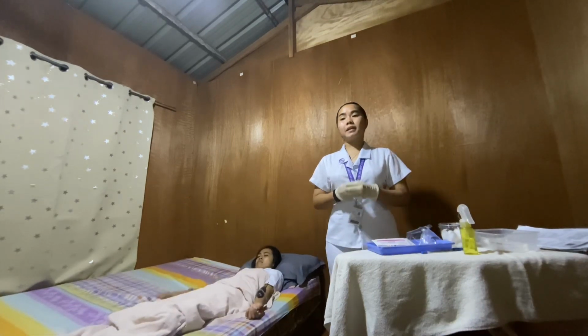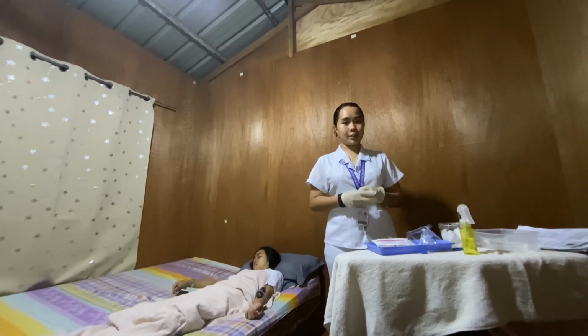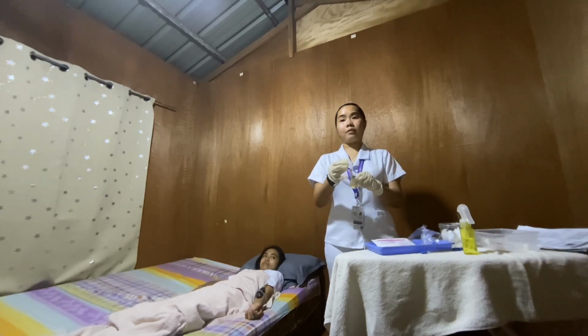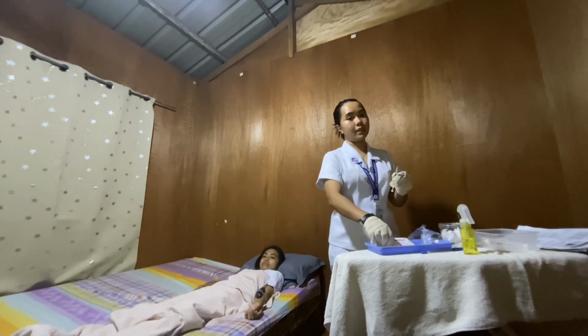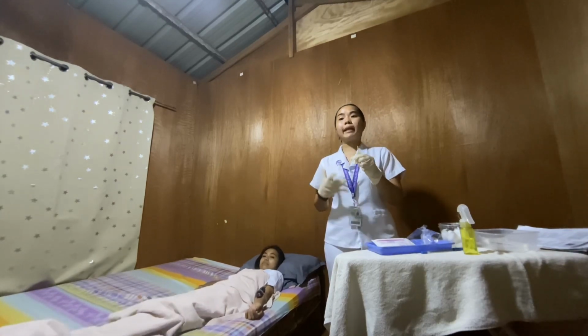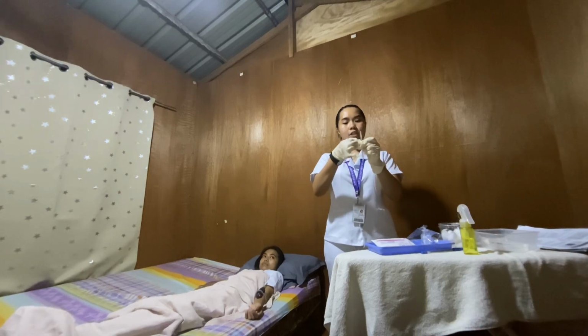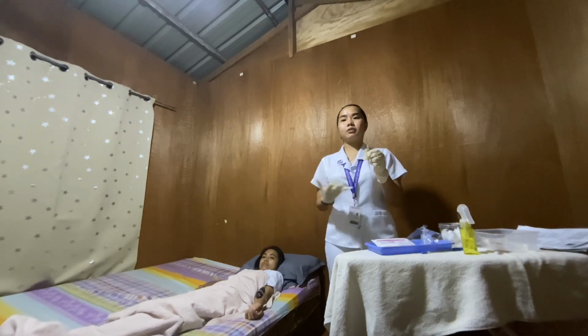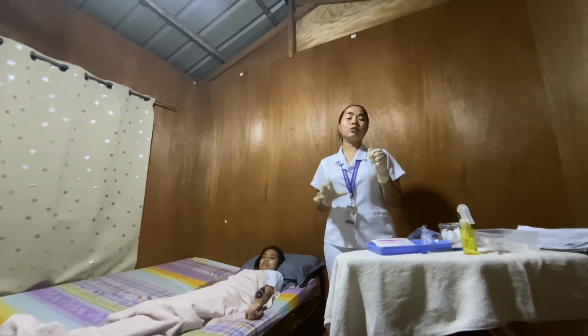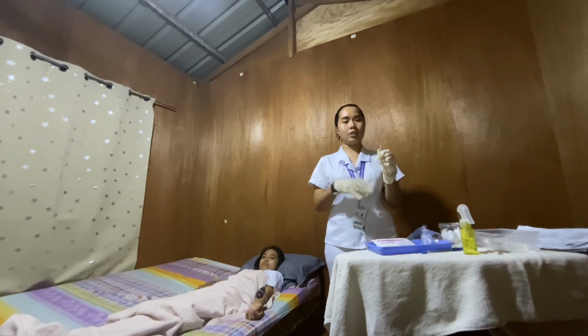So now I will be going to prepare the syringe for injection. I will remove the cap of the syringe while waiting for the antiseptic to dry. Next is to expel any air bubbles from the syringe. Small bubbles that adhere to the plunger are of no consequence, and a small amount of air will not harm any tissues.